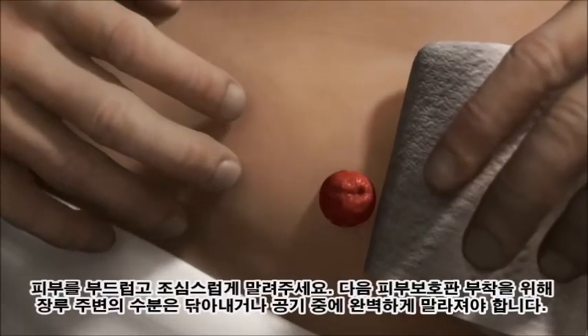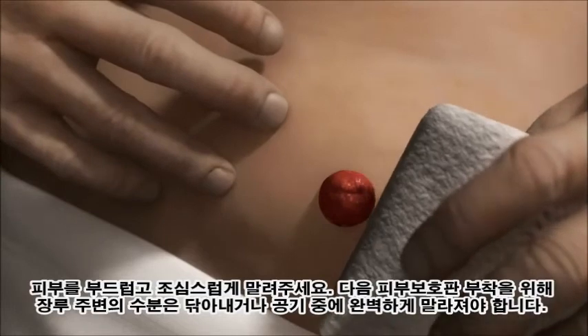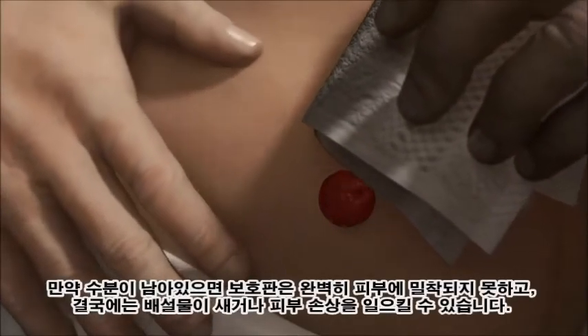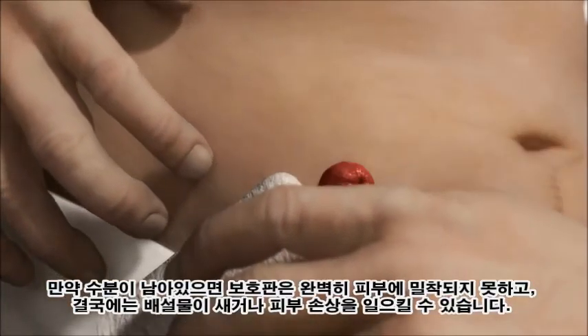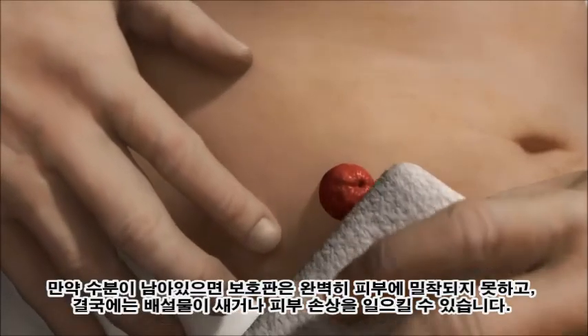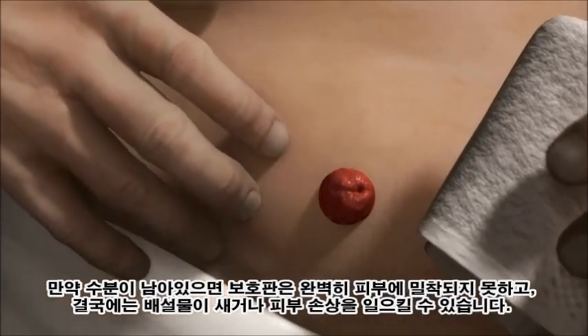Dry the skin gently and carefully. Any moisture on the skin around the stoma should be dabbed off and the stoma allowed to air dry. The skin must be completely dry before applying the next adhesive. If there is any moisture, the adhesive will not make full contact with the skin, resulting in risk of leakage and skin irritation.